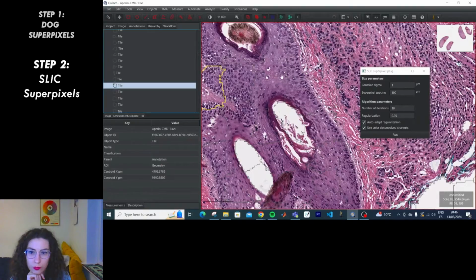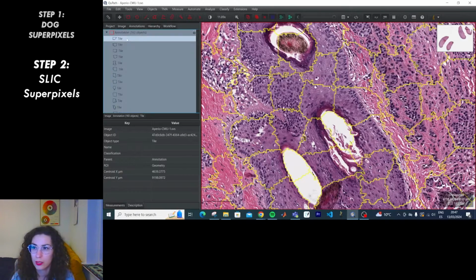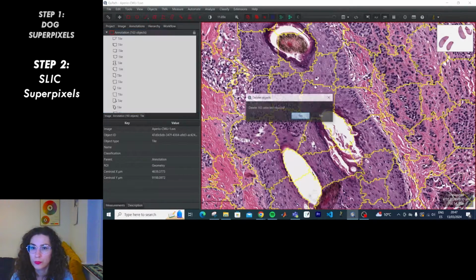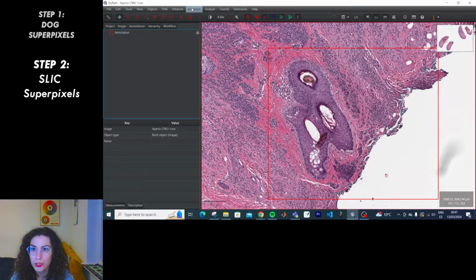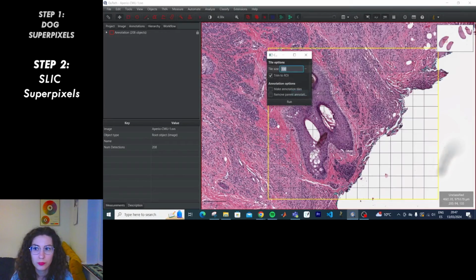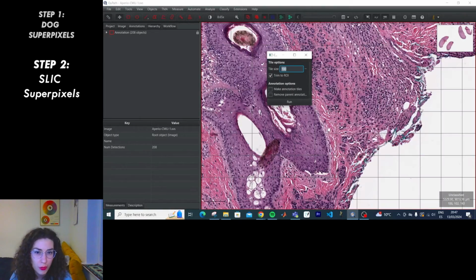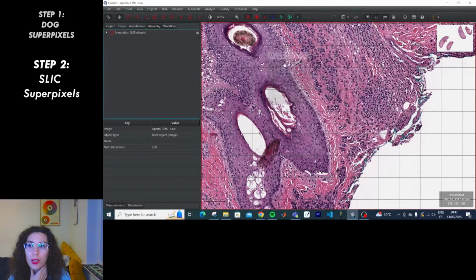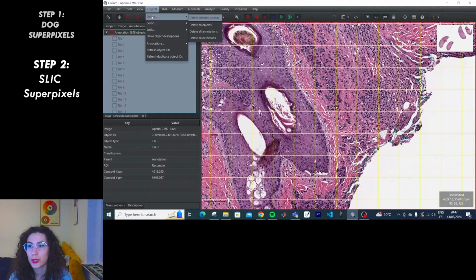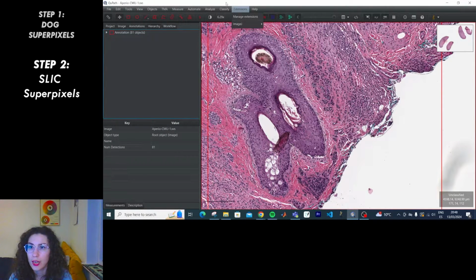A bit better, this one. Yeah, not very good at separating regions, is it? Then our other option is to just create tiles. Which, judging by the appearance of the superpixels, they're not that different really, maybe for specific tasks. But still, we're going to do the whole tutorial, and we're going to learn how to analyze the features and classification with superpixels.